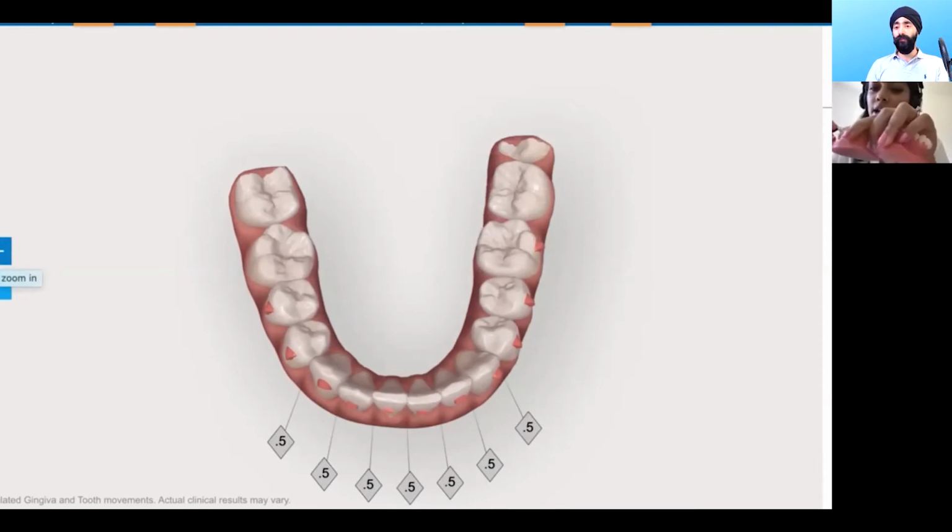Yep, go for it. Okay, there's no space in there, but either you go through this way or you go through downwards. And it should be the same thing? Slip in. Yeah, either way, it should be the same. Yeah, through the contact point. Thank you for that. It's really handy to see.